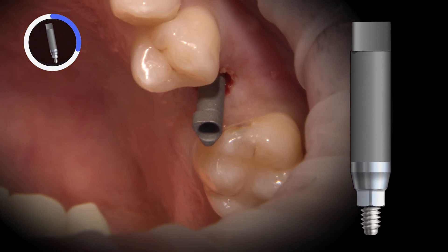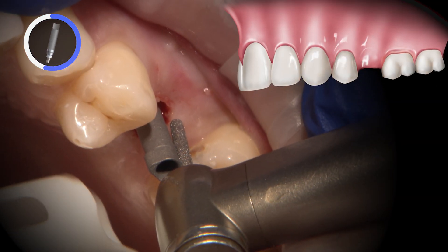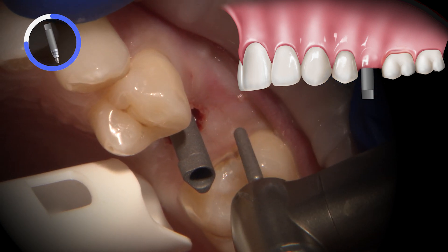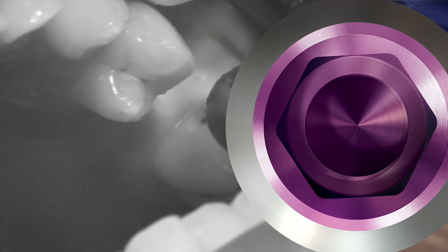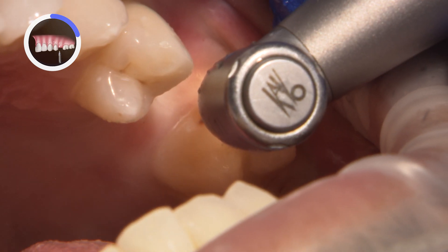I like to use the scan body to assess the path of insertion. When evaluating this path, I want to make sure I have a nice guide plane on each adjacent tooth. This plane should be parallel to the long axis of the implant, which is represented here by the scan body. Sometimes this means I am performing enameloplasties on the adjacent teeth.